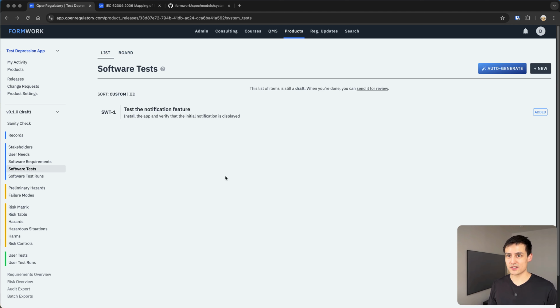And if you have questions about automating stuff and you still don't believe me that 20 to 30 manual tests are the way to go, you can always ping us for consulting, but you can also save your money and just go with this, because again, 99 times out of 100, this is the most pragmatic solution.